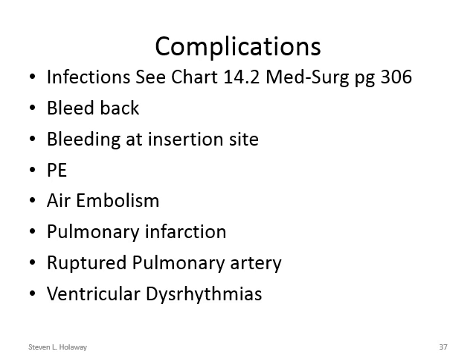Some of the things that can happen, you can have bleed back. Again, if you don't set up your stopcocks correctly, you can see a bleed back. I have seen that happen. You can have bleeding at the insertion site. You can develop a pulmonary embolism, an air embolism. You can develop pulmonary infarction, especially if that catheter moves too far downstream or someone leaves the balloon up. You can have a rupture of the pulmonary artery. Again, if it's down too far and we try to blow up the balloon, we can rupture a small pulmonary artery capillary. And then as you're putting it in, because it's going through the right ventricle, it can cause dysrhythmias as part of that process.